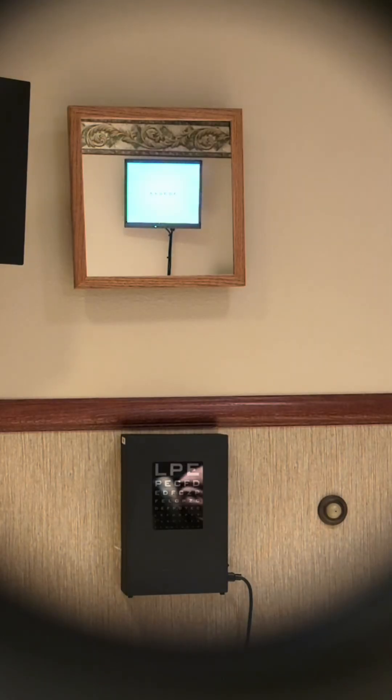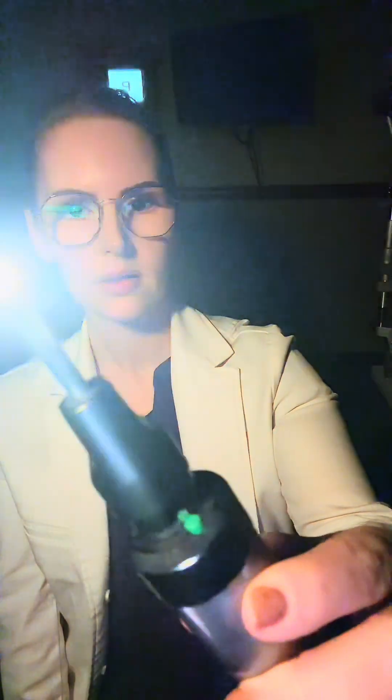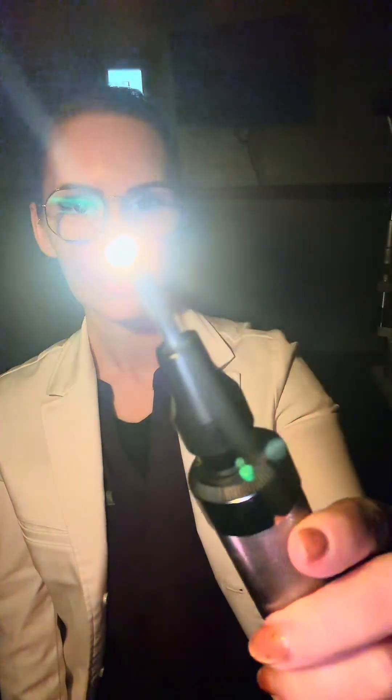Alright, go ahead and sit back, just look straight ahead. Past me towards the wall behind me — I'm just going to take a look at your pupils here. Good, I know it's really bright. Almost done. Okay, I want you to look at my finger with your eyes only — don't move your head — and just follow my finger. This is checking your eye muscles, making sure your eyes can move in all gazes without restriction.